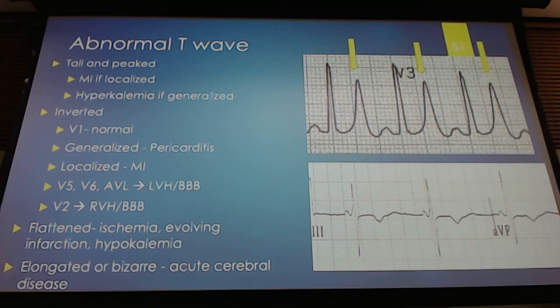And then the light bulb went off, and I said, look at this EKG. And on her EKG, she had like these diffuse T wave inversions, even though troponin was negative. And I said, I'll call you back. I spun her head, she had a cerebellar infarct. Cerebellar infarct, meaning all the way down here, okay, cerebellar infarct.